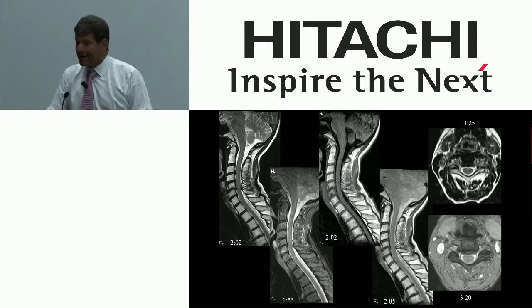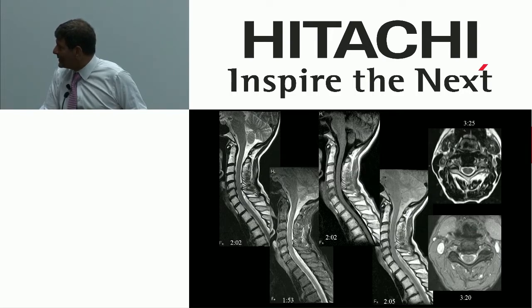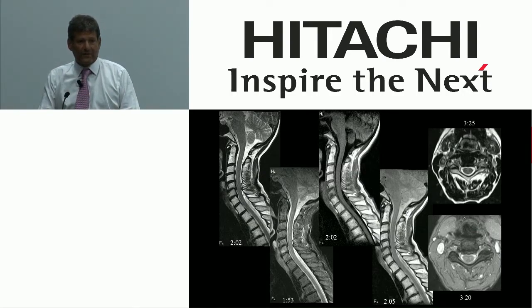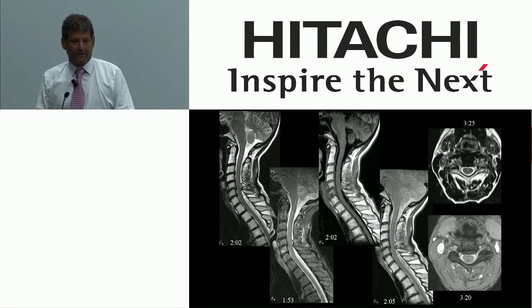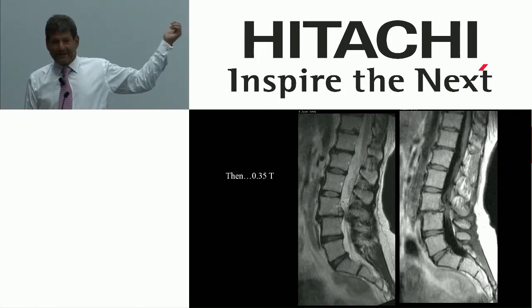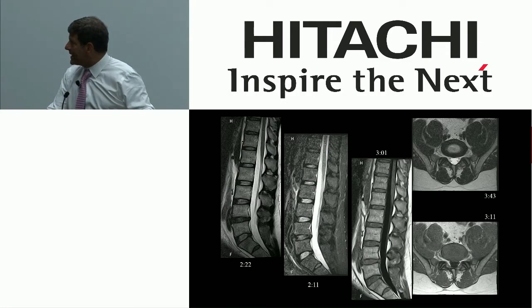And take a look at those scan times. Can you do better than that? Sure, knock yourself out. But look at those scan times. 2 minutes, 2 minutes, 2 minutes, 2 minutes. Maybe another 7 minutes. Cervical spine with 1, 2, 3, 4, 6 sequences. That's what we expect. Again, this used to be, I put this in a magazine. It's probably in that magazine article. Okay, this is the kind of work we get today.